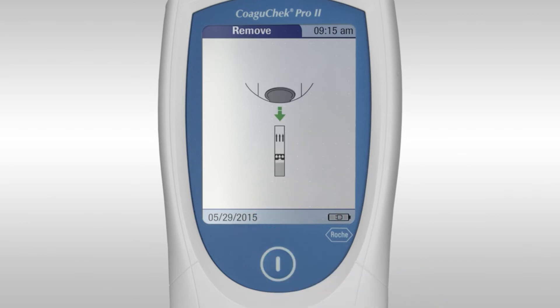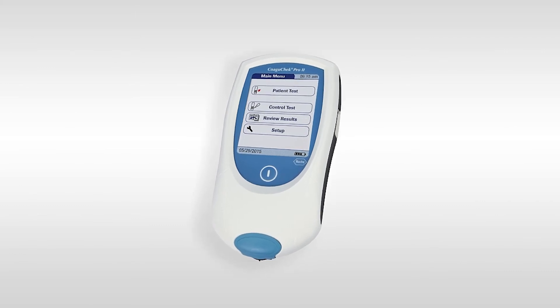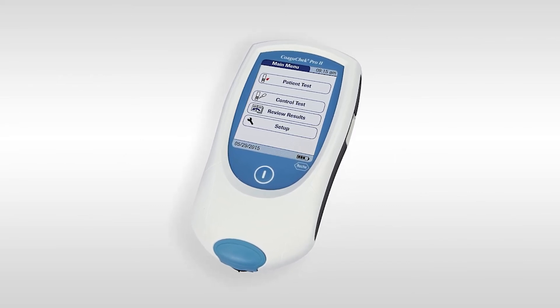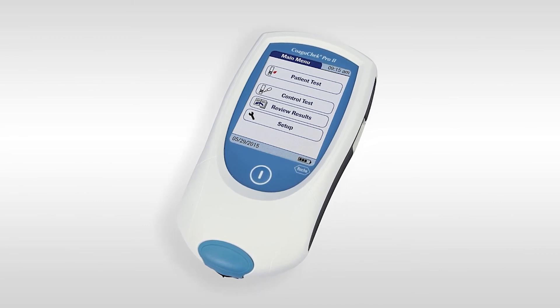By pressing the main menu button, the meter will prompt you to remove the test strip. Please dispose of the used lancet and test strip as per your local guidelines. If the test fails, for example due to a sampling error, please repeat the test using a new strip and a fresh site for the lancet.